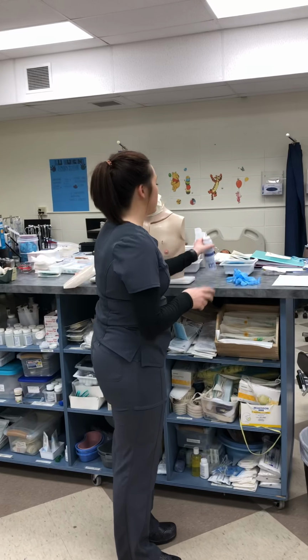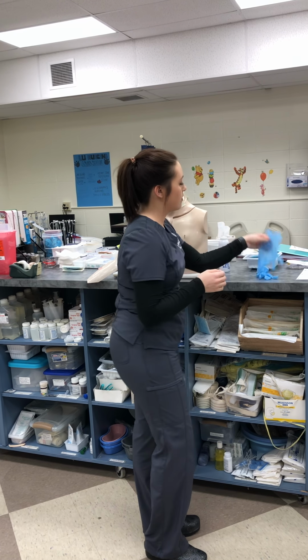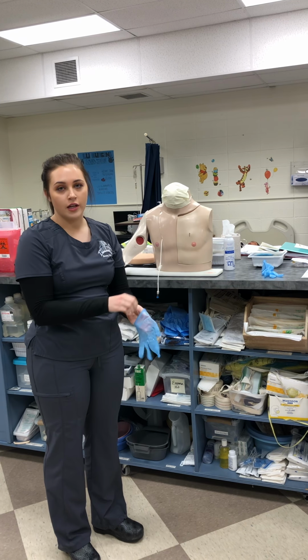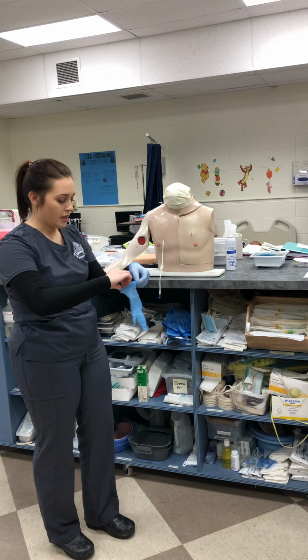So first, I'm going to put on my hand sanitizer, and I'm going to put on my clean gloves, and this is so I can palpate the port and get an idea of where I'm going to be inserting my needle.